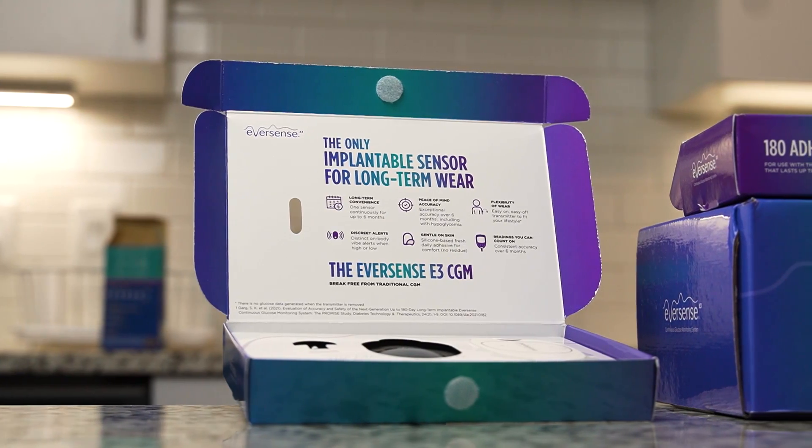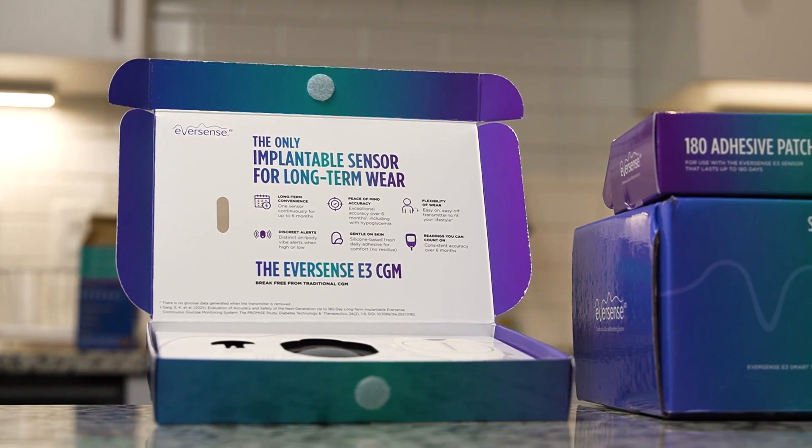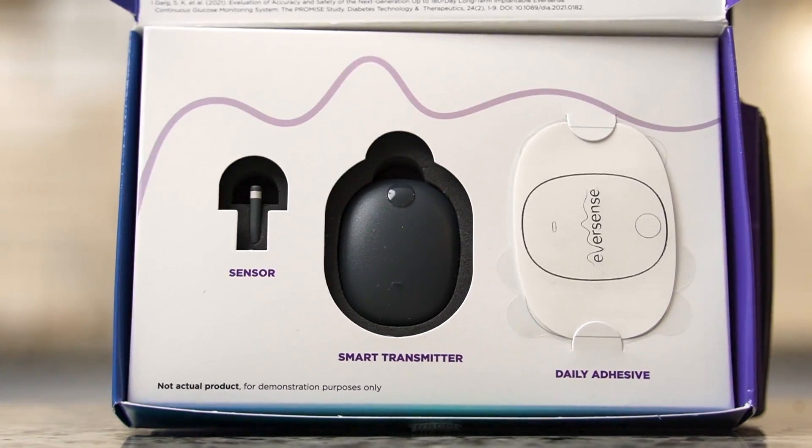My name is Chris Rudin and I was one of the first in the country to get the Eversense E3 CGM. Today we're going to be talking about the good, the not so good, and everything in between, and how it compares to other CGMs on the market like Dexcom, Libre, and anything else that might be out there.